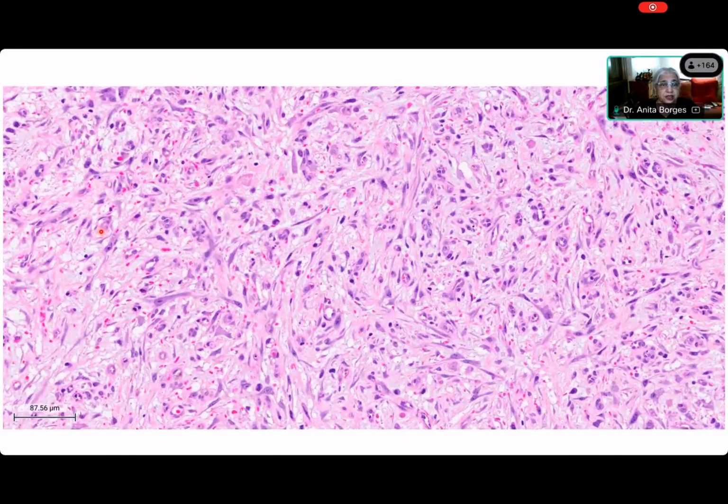And those who have not seen stellate cells in their lives, please see stellate cells now. These are all stellate cells. They do not have spindle nuclei. So full marks to you, Elsa. You have noticed that there are definitely spindle cells. You see, these are spindle cells. That's a spindle cell. But there are lots of stellate cells. Excellent. Here is another part of this lesion.